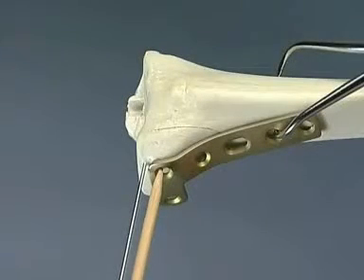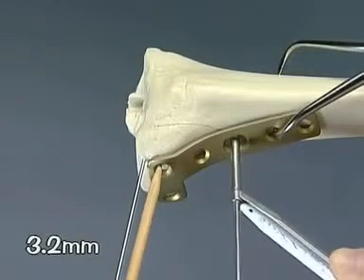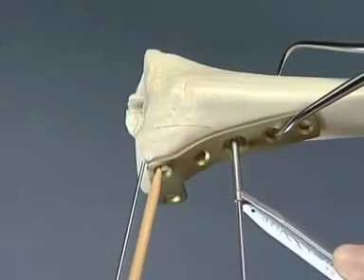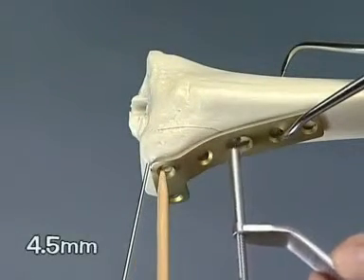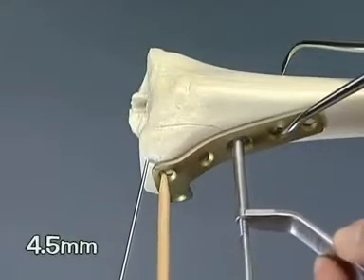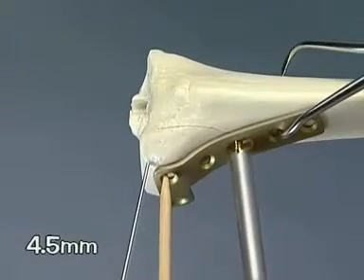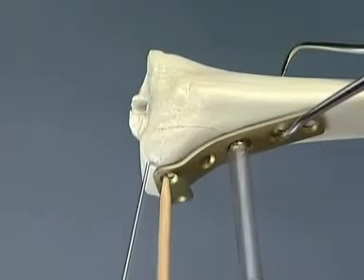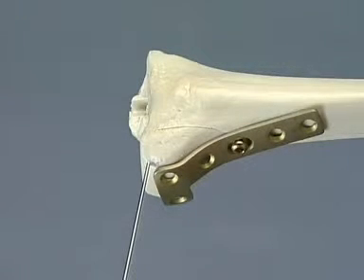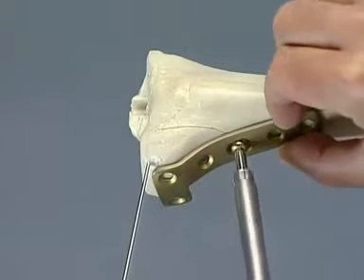Place the contoured L buttress plate on the bone and fill the oval screw hole with a 16 mm long 4.5 mm cortex screw. In this way, it's still possible to find the optimal position for the plate.